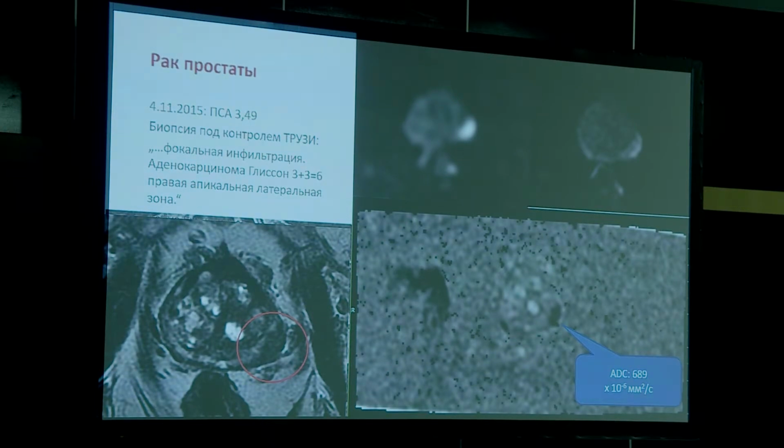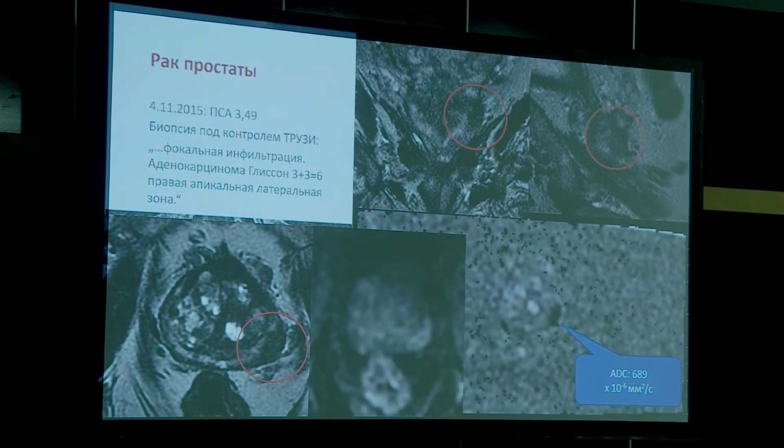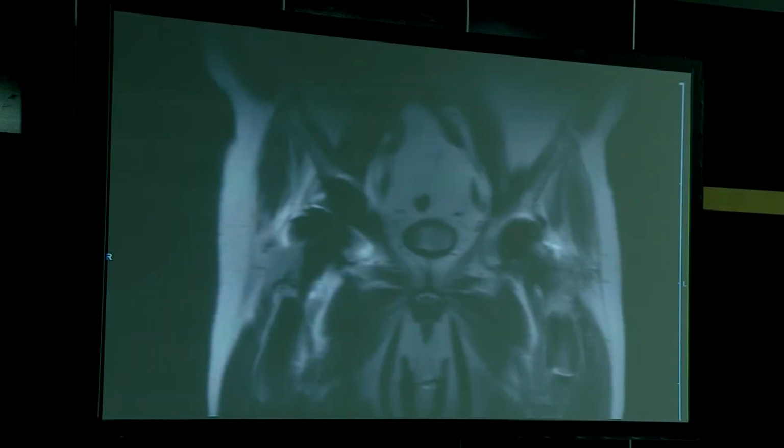So what happened here? The Gleason 6 cancer, which the patient probably is not going to die from, was sampled by biopsy, but the high-grade lesion at the base was missed. That's due to the inherent problem with prostate biopsy, that you have a possible sampling error. So this quite acceptable image quality in this patient was achieved, even though he had bilateral hip prostheses.